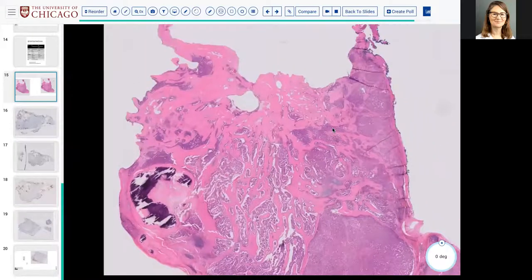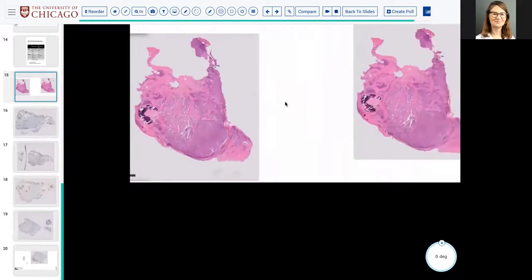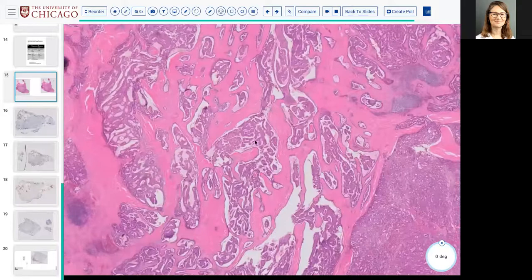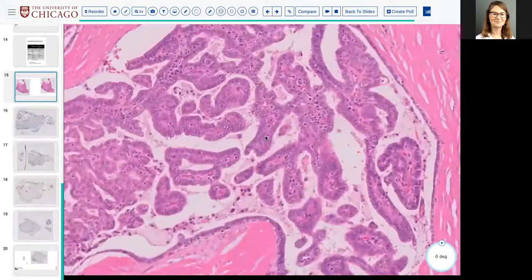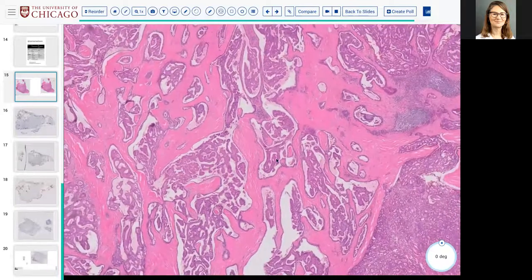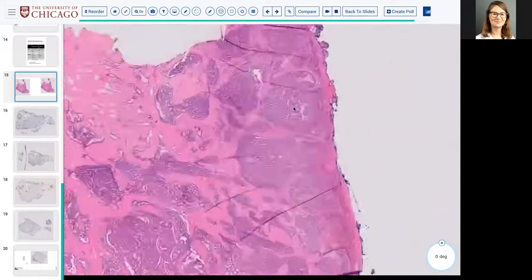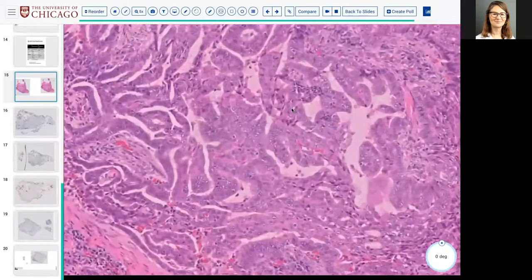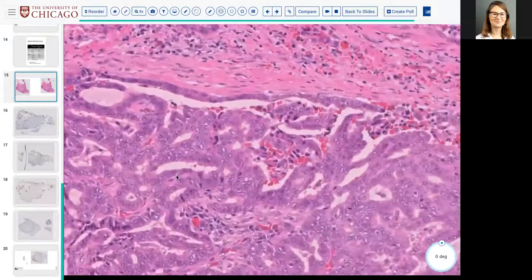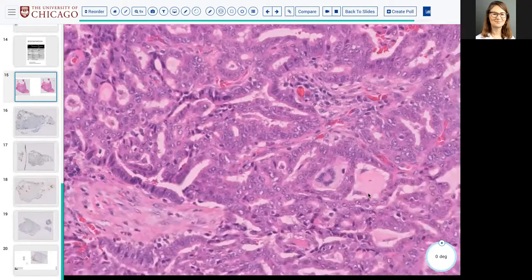I mean, it looks kind of bad, right? It's big. It's got a lot of fibrosis. It's got some calcs. It's got some follicles. It's got some papillae. Anybody want to shout out what they think? Does it have very convincing PTC-like nuclei? Yes, we have those.